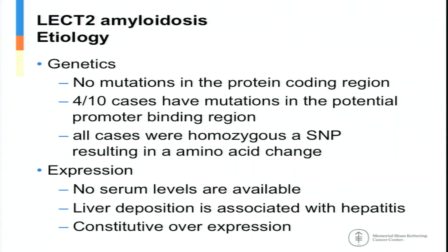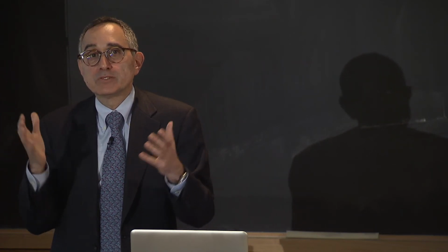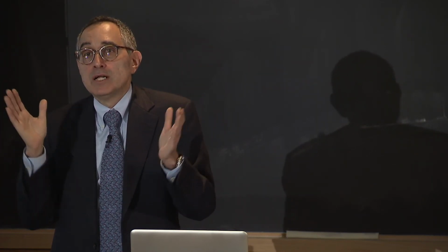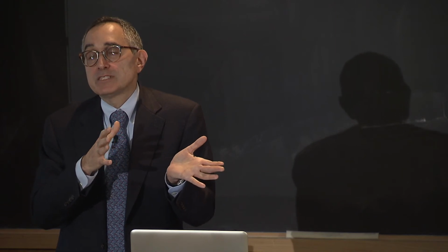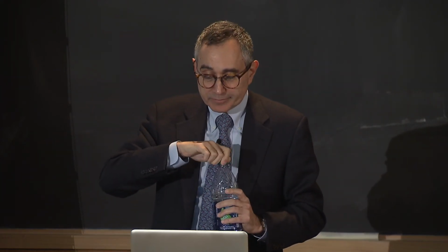So, without this kind of technology, I'm wondering how many other diseases there are that we don't know, to which we assign other meaning or other diagnosis, because we see what we know. The advantage of mass spectrometry proteomics is that you see everything. And whether you can assign meaning is the challenge there.